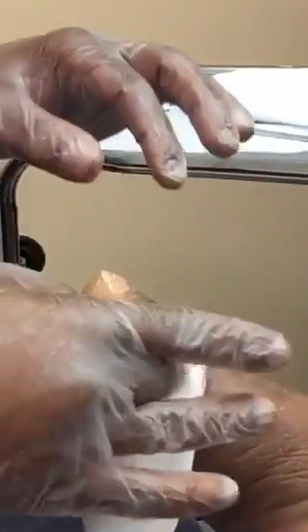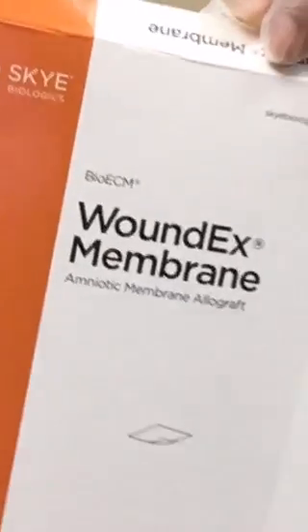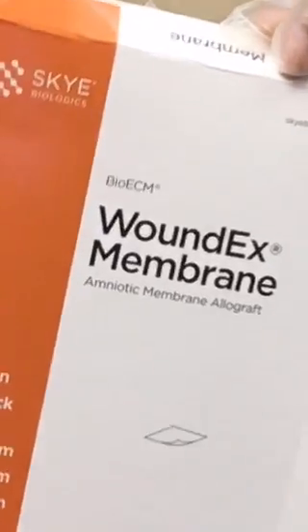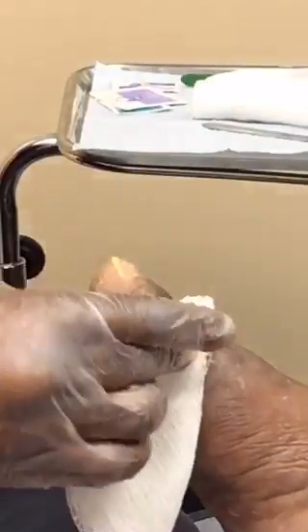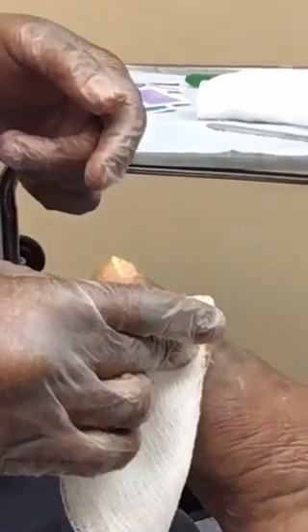While we're getting some hemostasis — getting the blood to stop flowing — we'll prepare our graft. What we're applying here today is the WoundEx membrane, which is amniotic tissue. Human donated amniotic tissue is very good for advanced wound healing. Inside the package, it comes sterile.